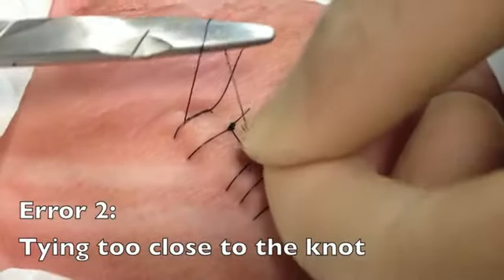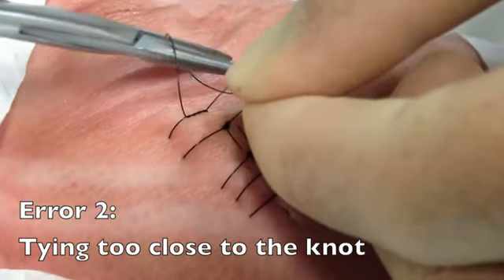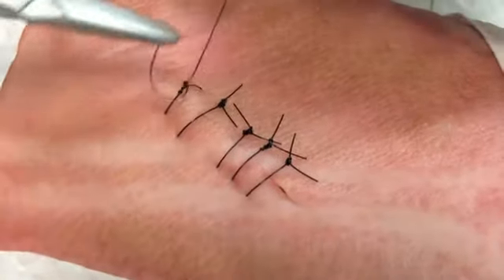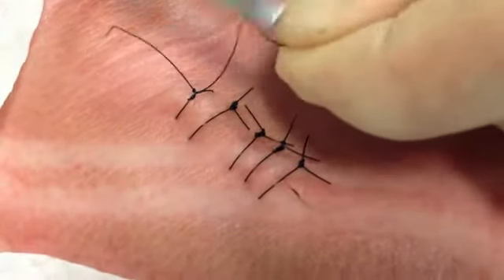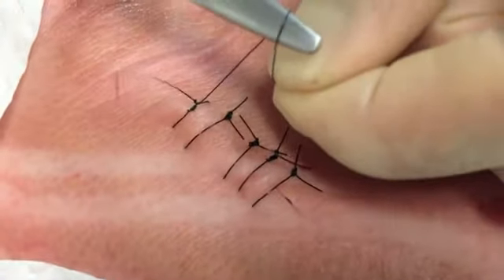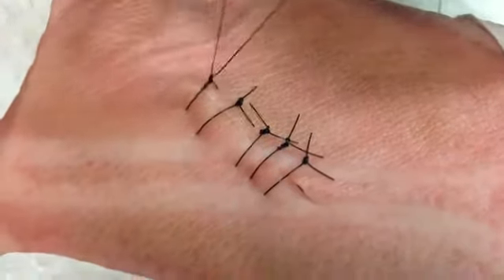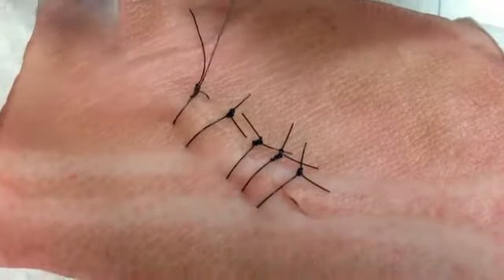The second error that I often see is tying too close to the knot. So basically, as I showed in my other demo video, you want to try and do your loops really far away from where you're going to end up tying. If you do it right over the knot, what you risk doing is pulling upwards on your knot as opposed to across the wound, and that's going to leave you with what's called a floating knot that really does very little to help hold the tension on that wound.